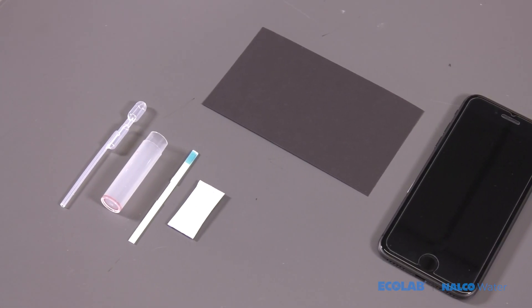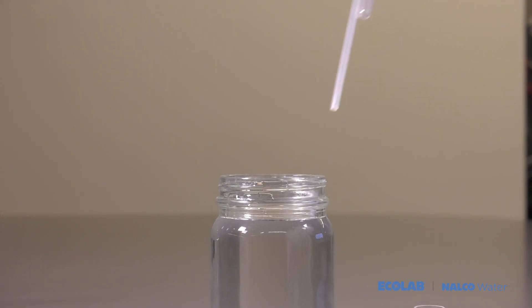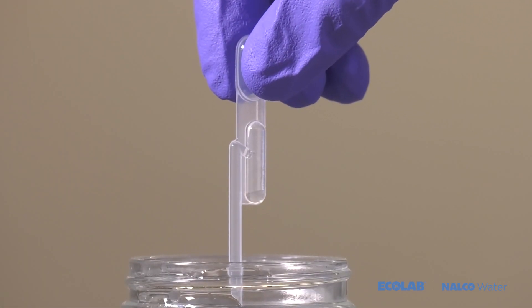We'll now go over a few quick and easy steps on how to run a test. Add the water sample to the test vial using the pipette, one squeeze.